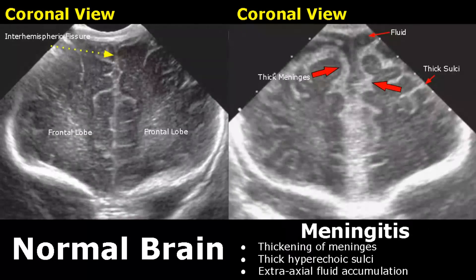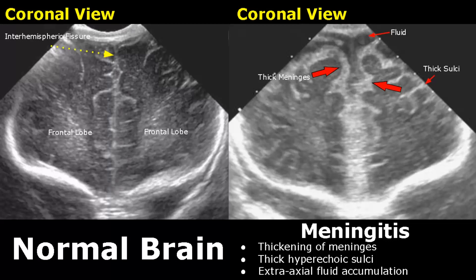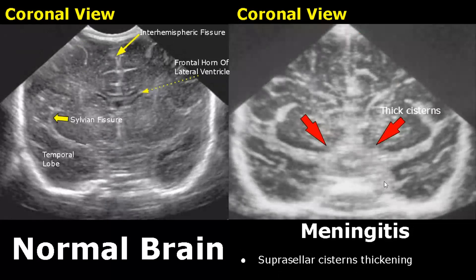This image shows the normal frontal lobe of the brain. In meningitis, the meninges are thickened and hyperechoic. Even the sulci are thick and hyperechoic. Some fluid accumulation is also seen — this is called extra-axial fluid. Thick suprasellar cisterns will also be found — you can see the difference in thickness of the cisterns.